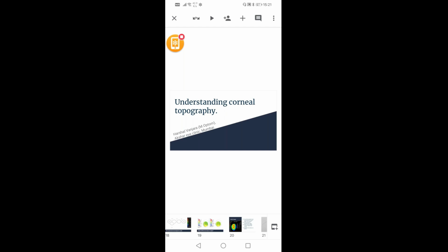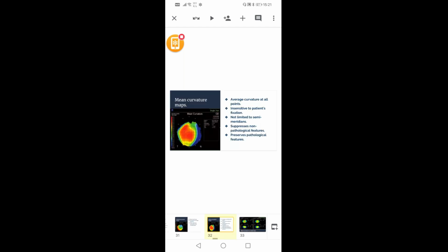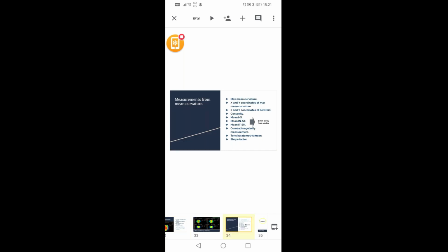Can Mr. Rahul turn on his mic? We can have a very good conversation on this. It's a very good question, but Mr. Rahul, can you please come on the mic if you don't mind? Yes, very good. Thank you for turning on your mic. So basically, you asked why we can't fit based on only the central.